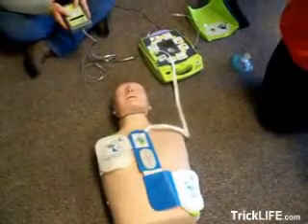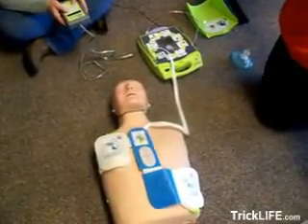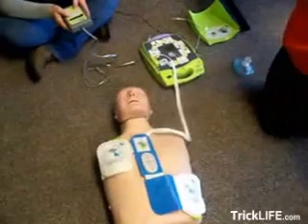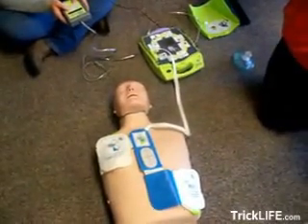Don't touch the patient. Analyzing. Treatment advised. Don't touch the patient. Press the treatment button. Treatment delivered. Don't touch the patient. Analyzing.